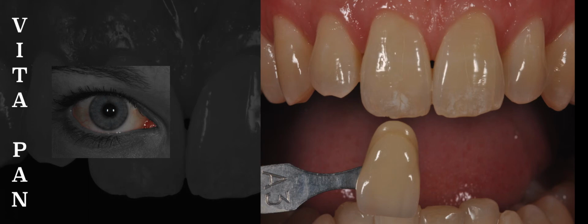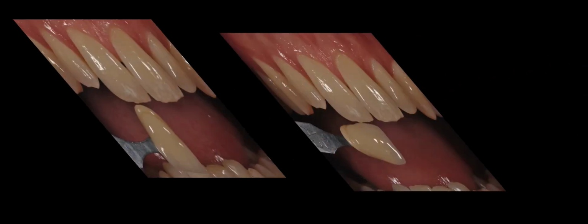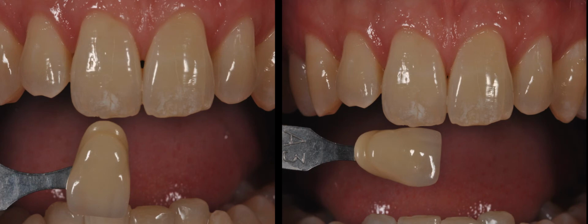You can see that the saturated portion of the tab will give us a false negative because it seems darker than the tooth. But if we place the same tab horizontally, things change. Look how now this shade tab matches the shade present in the middle third of the tooth. Same shade tab, same amount of ambient light, and same set of eyes.